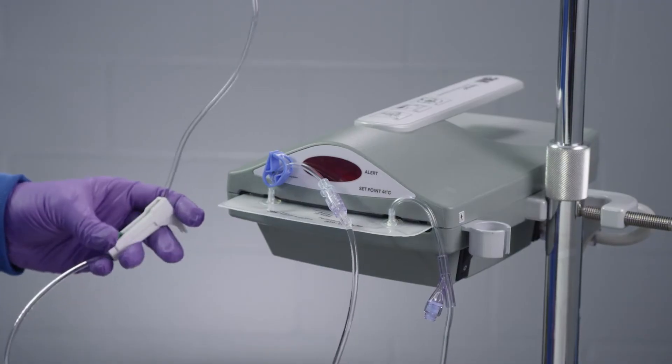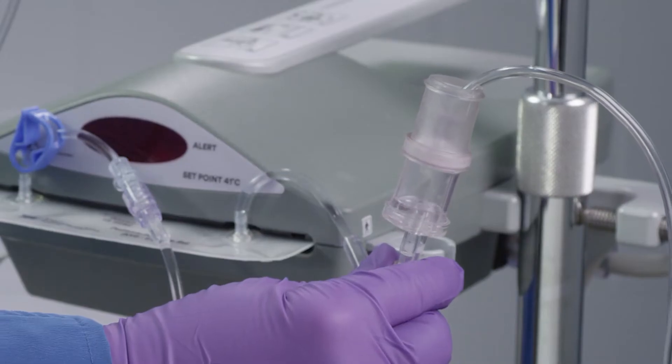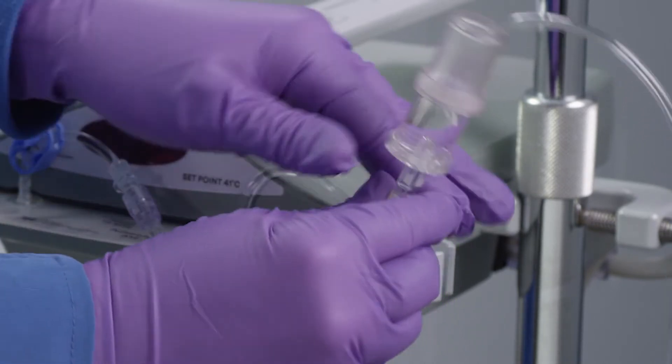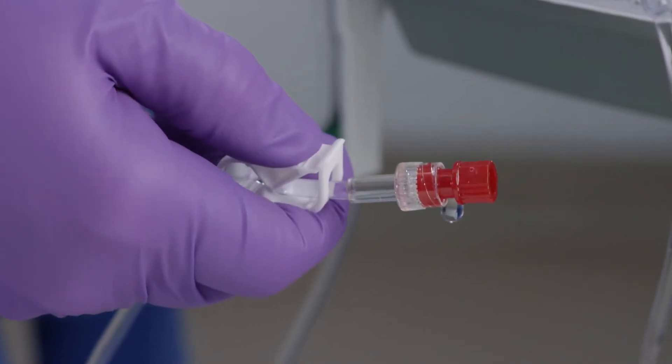Prime all tubing to purge air from the line. Invert the bubble trap while priming and fill. Turn the bubble trap right side up and prime the patient line. Place the bubble trap right side up into the holder on the warming unit. Close all clamps after the entire line is primed.